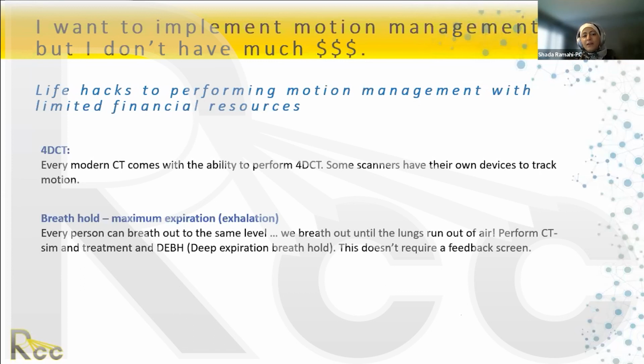If it is more than 5 millimeter, RTOG and the AAPM guidelines do not recommend using SBRT if the motion of the tumor is more than 5 millimeter, right? Those are the recommendations. So you can have your own clinical recommendations. As someone who's working in North America and representing an institution in North America, I can tell you if the motion is more than 5 millimeter, the guidelines say we do not treat with SBRT unless somehow we can compress the motion down to 5 millimeter or less.